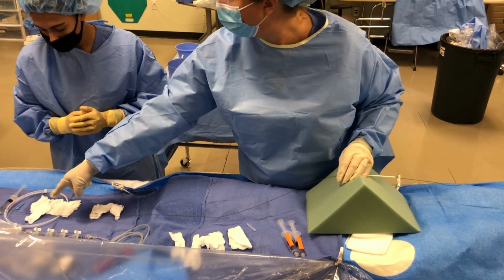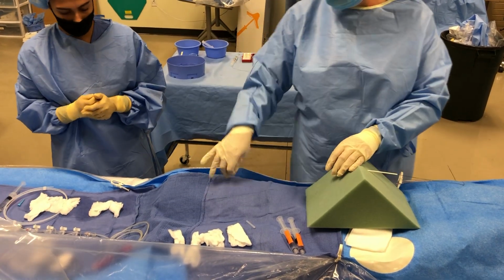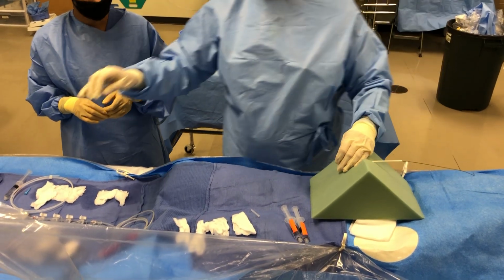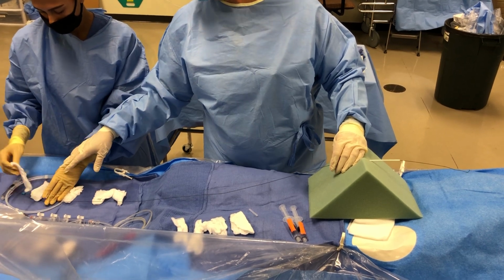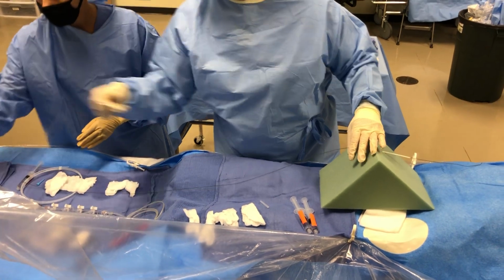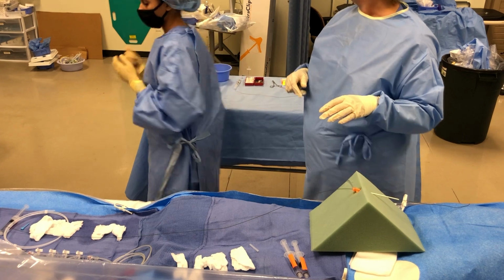That's your responsibility to make sure it doesn't go off the side of the table. And if the doctor's up here doing something, and it flips, guess whose fault it was? Not the doctor's. It's yours because you're supposed to be in control. And at this point, you might have turned, and you probably should be getting that sharp out of here. So put it, yep, in your styrofoam, perfect.